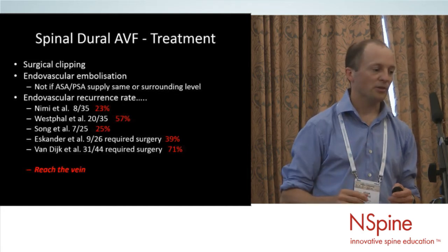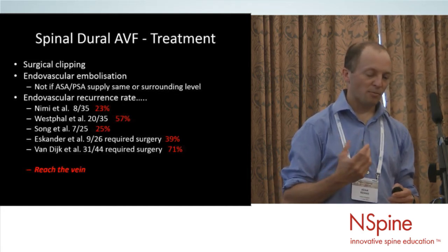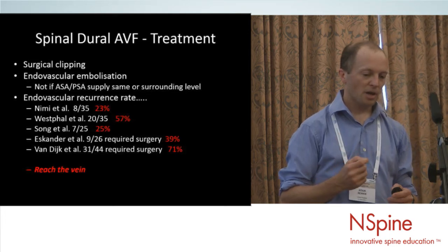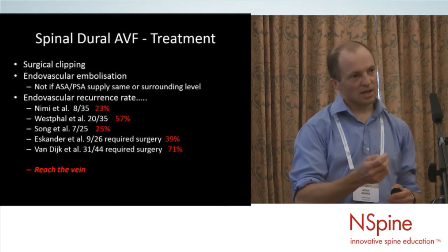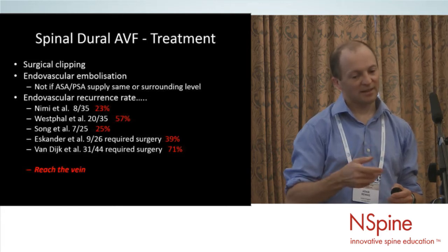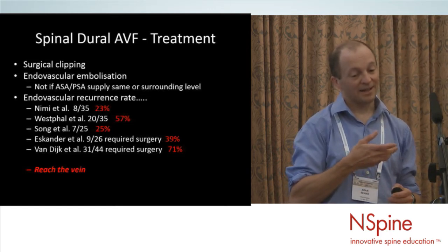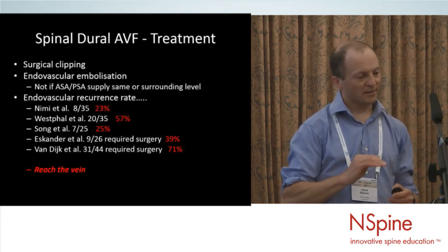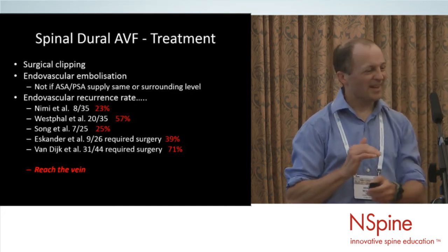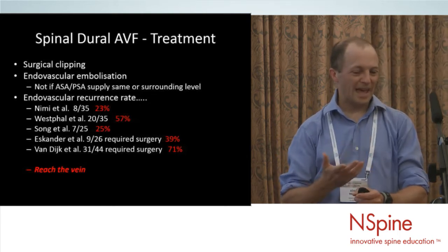Sometimes it goes in other directions. In terms of that, glue is great because it's very prothrombotic. By injecting a little bit, even a drop in the right direction, it allows thrombus to take place and allows clots to form, and thereby allows a suboptimally closed vessel to close. Onyx is non-adhesive and isn't as thrombogenic, and so it can often layer in the vessel.